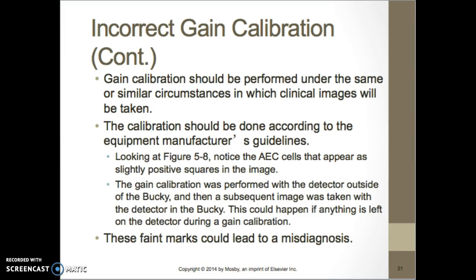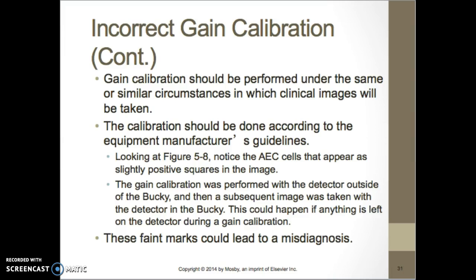problem. So gain calibration should be performed under the same or similar circumstances in which the clinical images will be taken. So the calibration should be according to the equipment manufacturer's guidelines. So looking at 5.8, notice the AEC cells, so you can see those here.